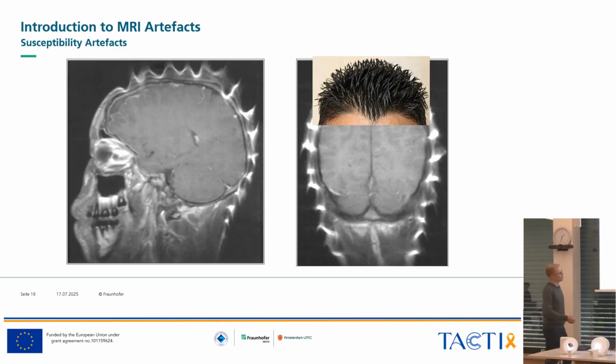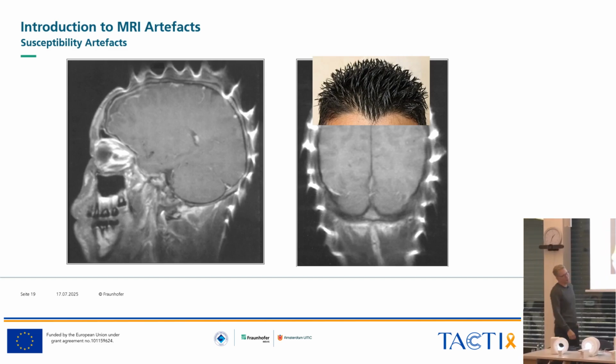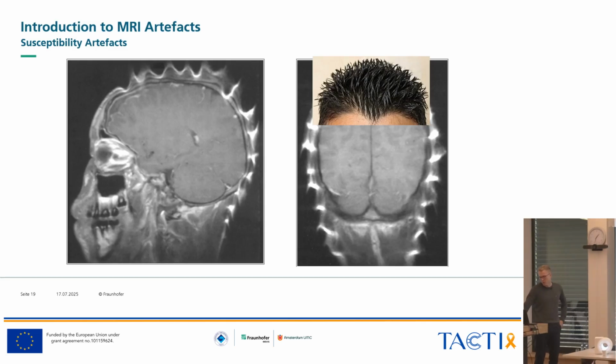So you really have a distribution depending on the type of hairstyle that the person has, where you have large areas of ferromagnetic particles, and they will introduce large fluctuations in your main magnetic field. So you get something just not really usable for diagnostics, maybe, but I'm not a clinician. No, I don't think so. But yeah, probably the person needs to wash the hair before the scan is repeated or something.